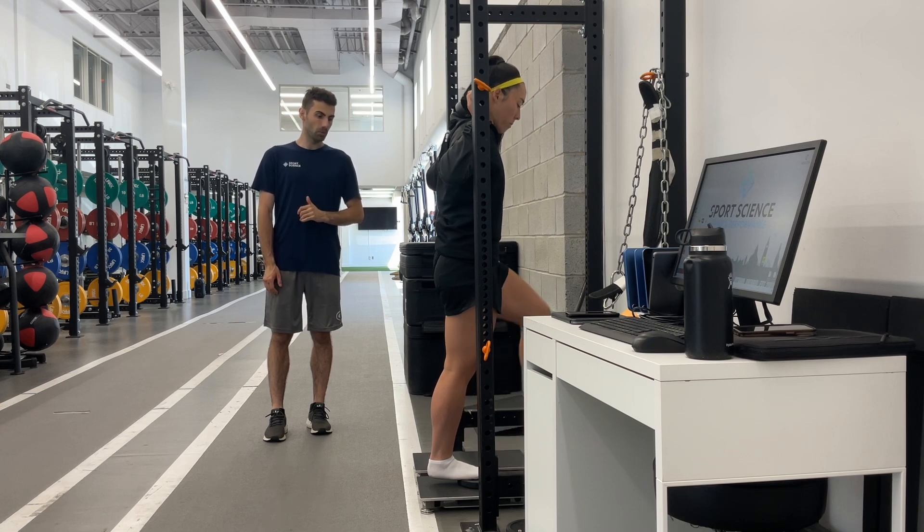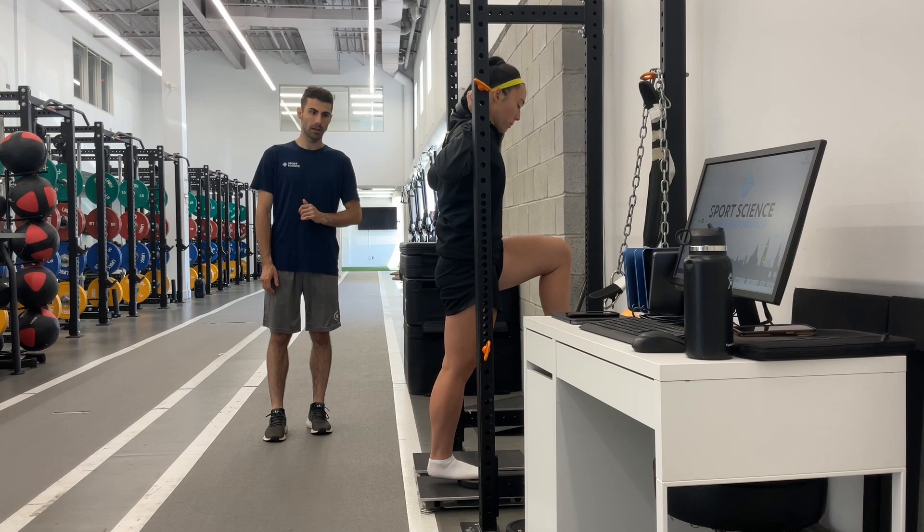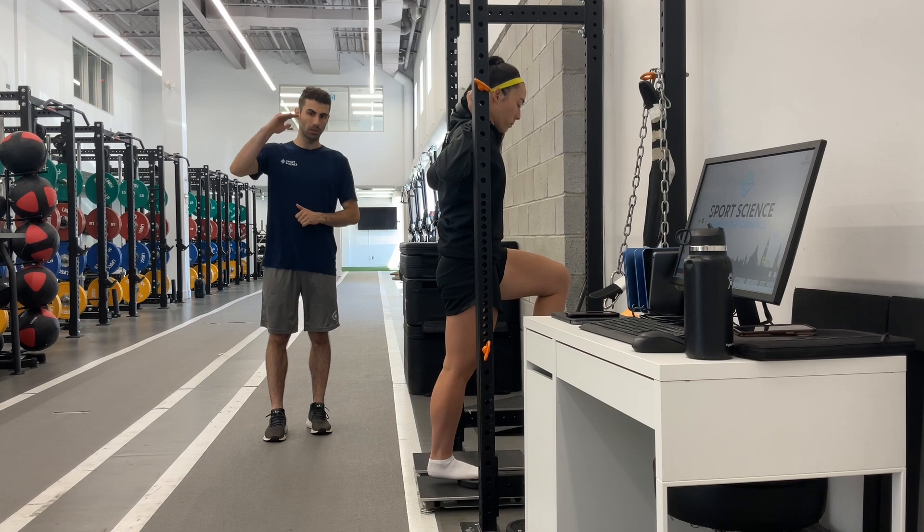Your opposite limb we're going to raise up so that we're in a hip flexion position at a 90 degree angle. Then we get the participant to hold at 105% of their body weight.